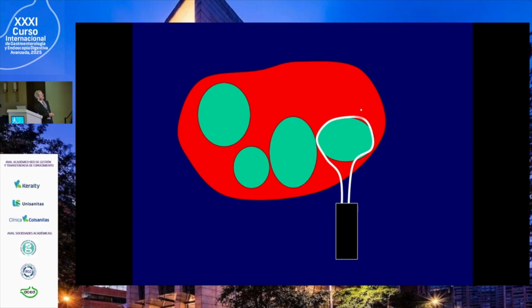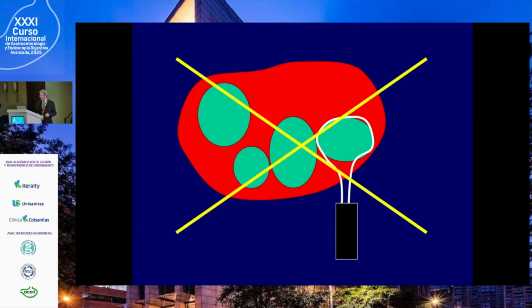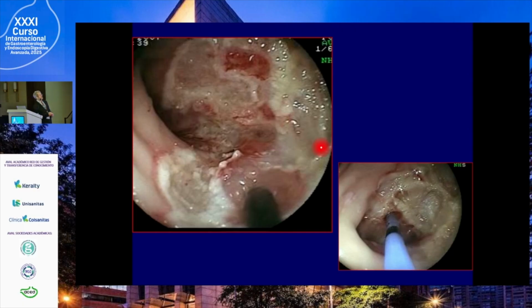So you perform, it's like a puzzle. You take one piece, and another piece, okay? But they are not coalescent. This is a disaster, okay? You agree or not? Not good. For example, in this case you see you have a lot of adenoma tissue in between. From a great French expert. And finally, he performed APC destruction. No, this is not acceptable, okay?